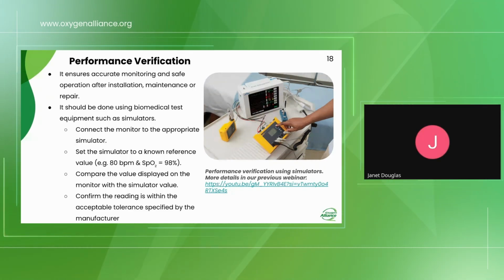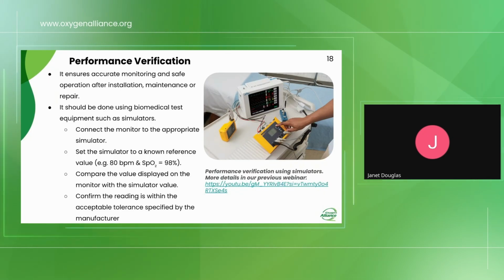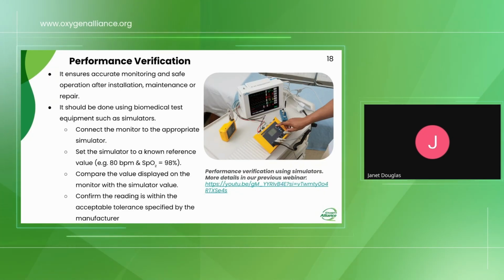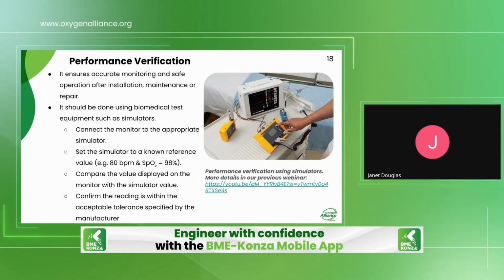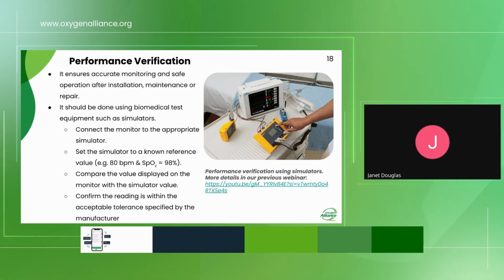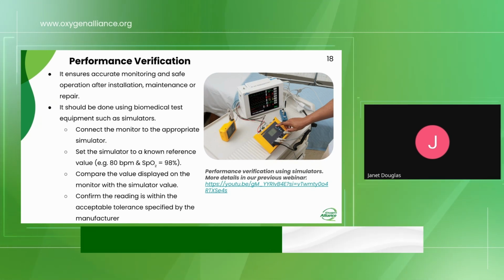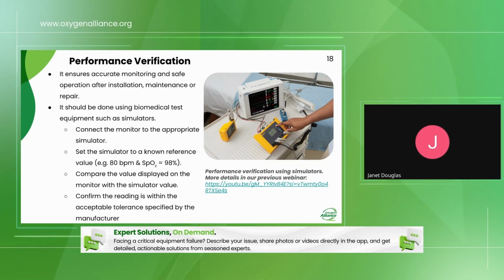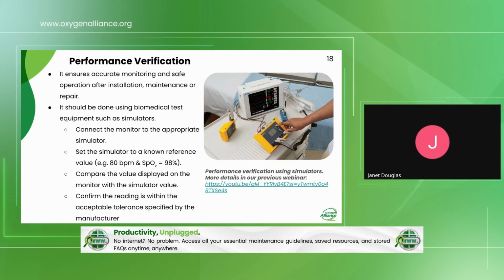All right, thank you. I hope you can hear me. I'm a biomedical engineer with Oxygen Alliance. I'll just take some of the questions. Let me start with the verification of the SpO2. Normally, to verify the functionality of the sensor, you use a simulator. That's the most recommended one, in as much as David had explained that you can just try to see if you're able to see the results. You put in your finger, you see the results.